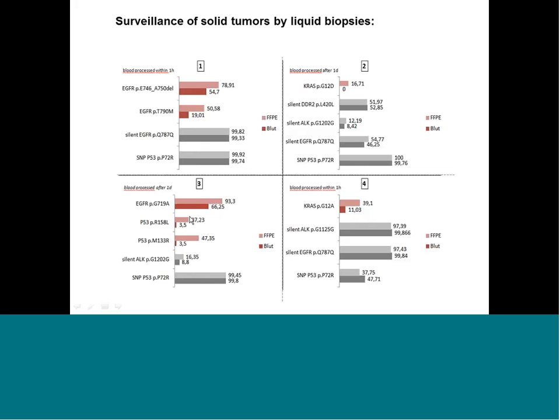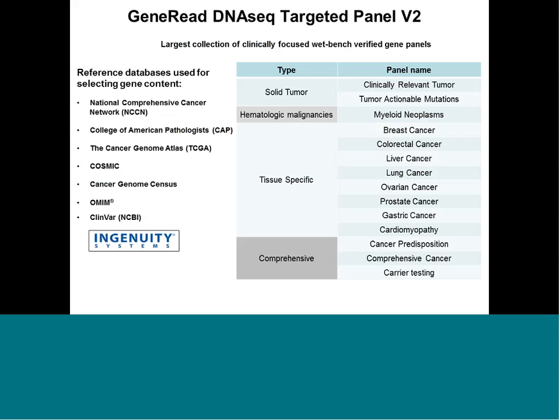If you analyze these patients too late and keep the blood for several hours at room temperature, then as you can see here, there is no mutation anymore in the blood, but it's still present in the tumor. So it's a sensitive technology which we need to learn and to practice in clinical applications.